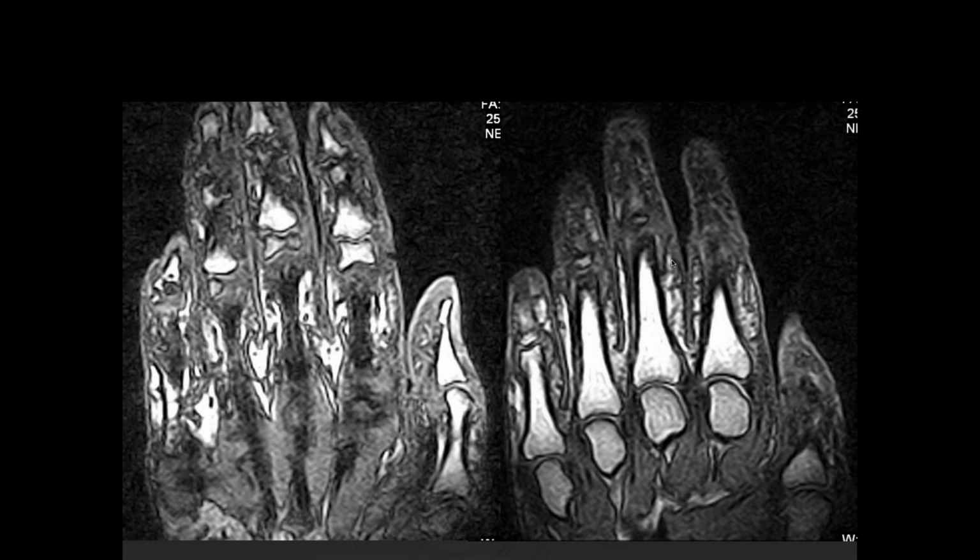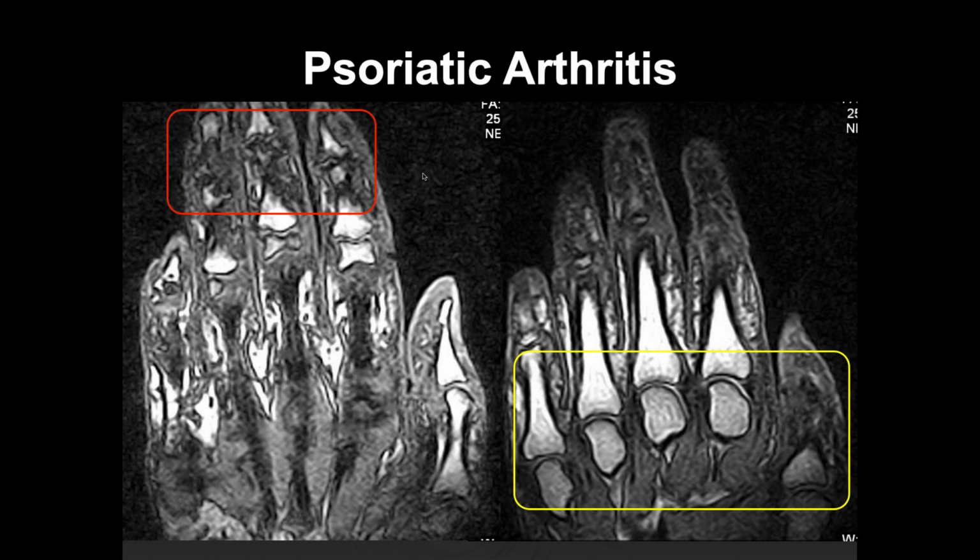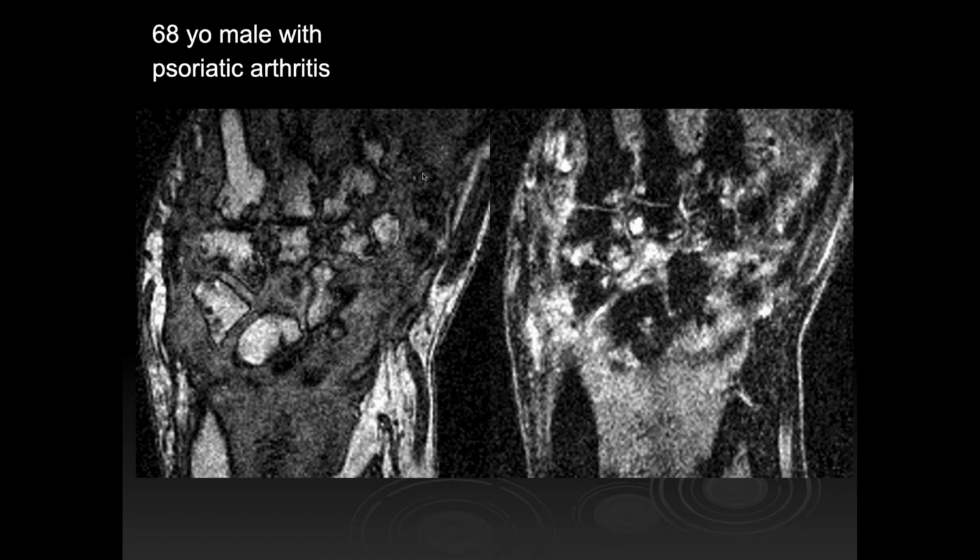Okay, so I don't know if that's just how it's cut, but it looks like there's kind of narrowing of the distal aspects of the middle, the intermediate phalanges, kind of like tapering and erosive change. Sorry, the DIP. Well, the distal aspects of the middle phalanges at the DIP joints. Yeah, but it's almost like the middle one, third digit. I was trying to figure out if there's some sort of pencil-and-cup type deformity. I don't know if it's just cut through it. Okay. And then you can tell that the MCP joints are relatively spared. So you're looking for a psoriatic arthritis type. Psoriatic arthritis. Yeah.